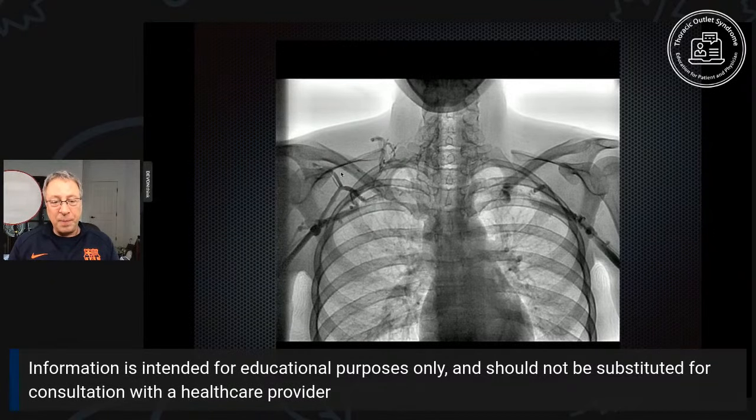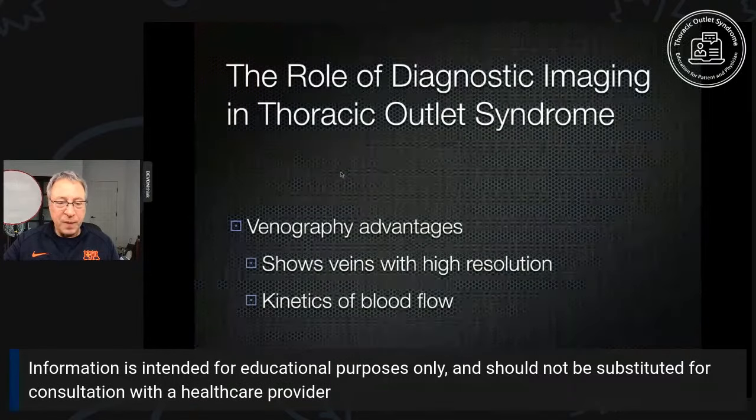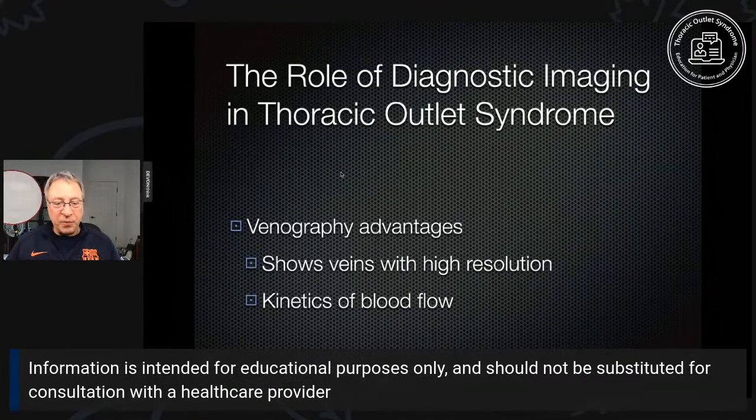We don't see these too often because in this country we have other tests. But Dr. Gamboa showed me this, and this is the test that they have to use. It's really kind of a cool picture for me. So what are the advantages of venography? Just like with arteriography, they show the veins with high resolution because we're pouring this dye or contrast into them.